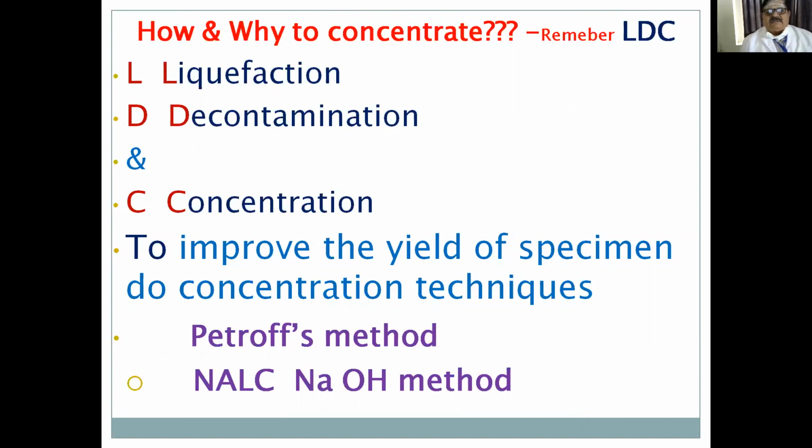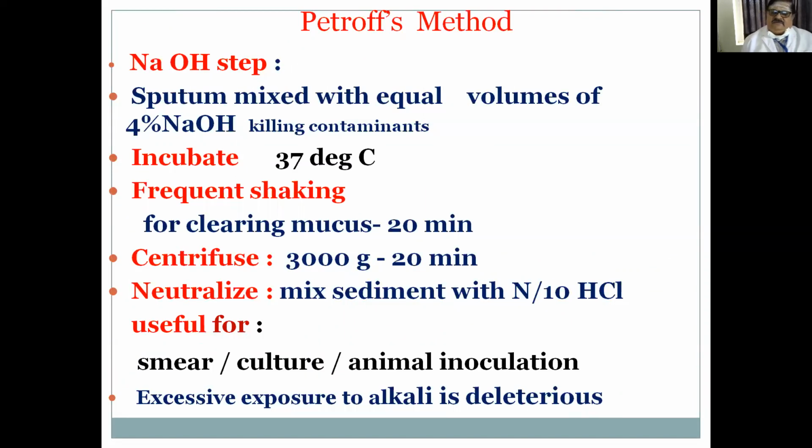Now, there are 2 methods of concentration, Petroff's and the NALC method. Let us see what they are. In Petroff's method, the first step is sodium hydroxide, NaOH. Why add NaOH? To kill the contaminants. It is mixed in equal quantities, 2 ml of 4% NaOH and 2 ml of sputum. Incubate at 37 degrees centigrade with frequent shaking. Why shaking? It helps in lysis of the sputum, clearing the mucus, for 20 minutes.